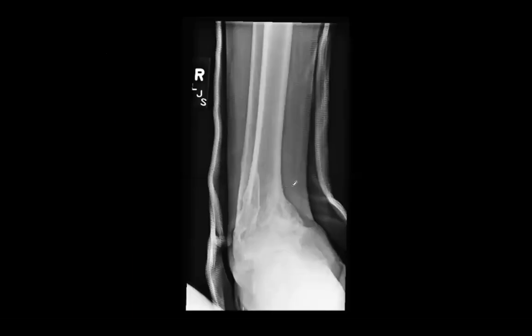Here's just an example that I found from one of our cases in residency, where you see this distal tibia that is actually rotated in itself. So you would get better use of your plafond malleolar angle, although you can't really tell where their ankle joint is. It's going to be more parallel like that. So this one would require supramalleolar osteotomy to straighten it out rather than at the actual ankle joint.